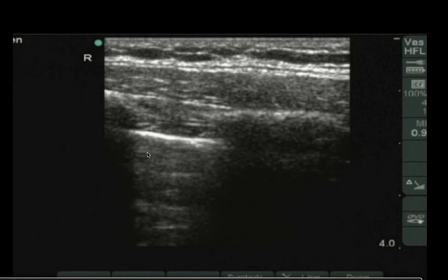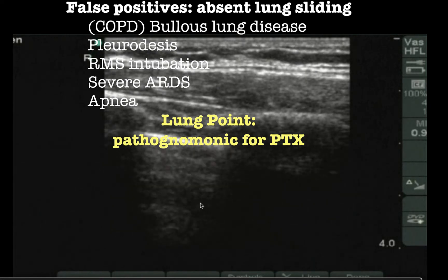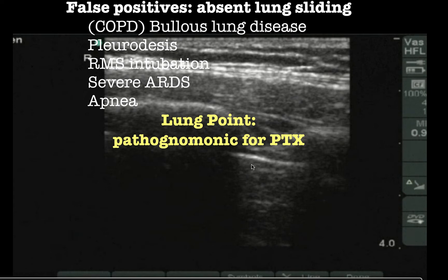Anything that makes the lungs not move will cause absent lung sliding. Although lung sliding was initially used for pneumothorax, other things can cause absent sliding: really dilated lungs like right main stem intubation, severe ARDS, pleurodesis, and apnea. However, if you have a lung point, that will always indicate a pneumothorax. So if you don't have a chest X-ray to confirm and the clinical story isn't definitive, look for the lung point before placing a chest tube.